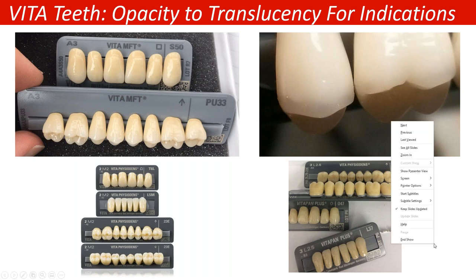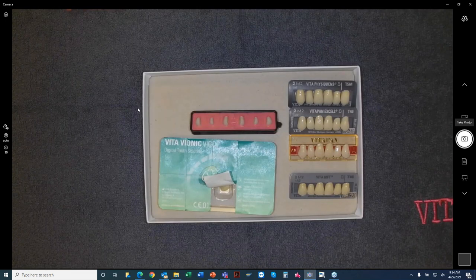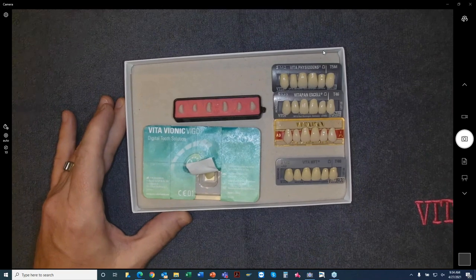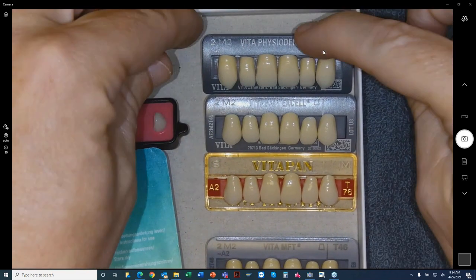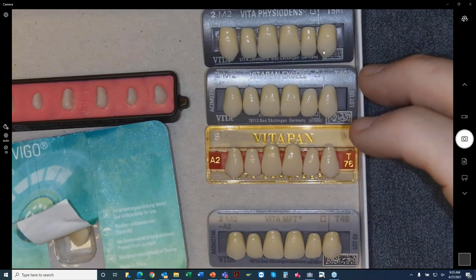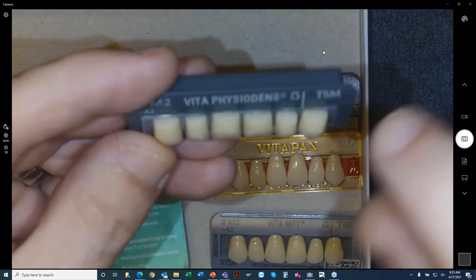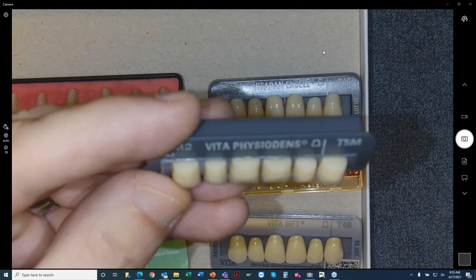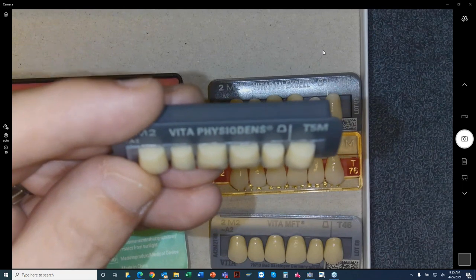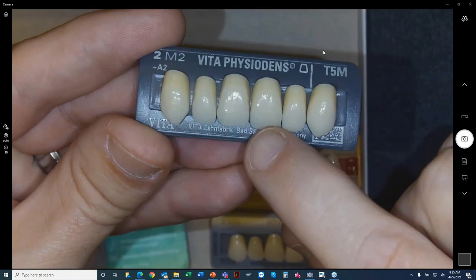So I'm going to go ahead and show you what I'm talking about a little bit more. Look on. Here we go. If you look at these denture teeth, I'm going to go over a couple of concepts. You've got these various denture teeth that VITA has: these are Physiodens, these are the Excel, the VitaPan, and then MFT here. These Physiodens are very natural looking. They're a little bit bulkier, but they're meant to recreate the natural teeth a person wanted back, that they had maybe when they were 20 or so. A little bit thicker at the basal, but they also have a nice translucency, as you can see here.